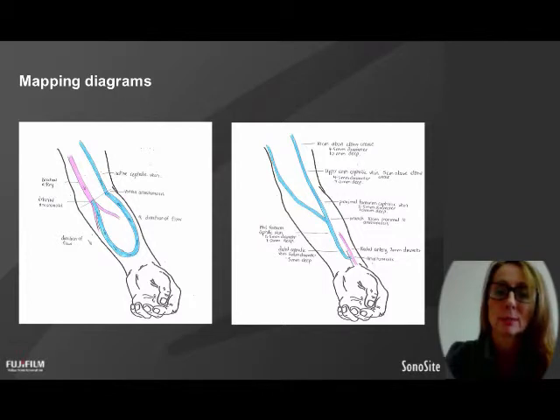And I've noted the depths as well, and that there is actually a branch in the mid-forearm, and how far above the elbow crease that is, particularly in the deeper vessels. If you can't palpate it, sometimes people will palpate just before it branches. It will feel nice and wide, but they won't realise that it's actually branching left or right, and then when they thread it, they actually have an infiltration.